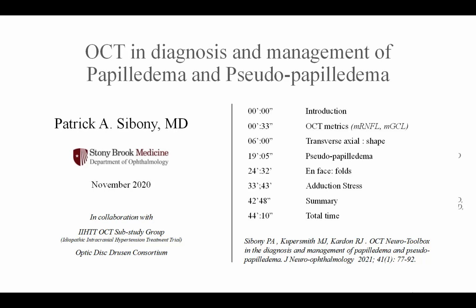Everything I'm going to discuss in this lecture can be done on any commercial device. I'm not endorsing any particular device.